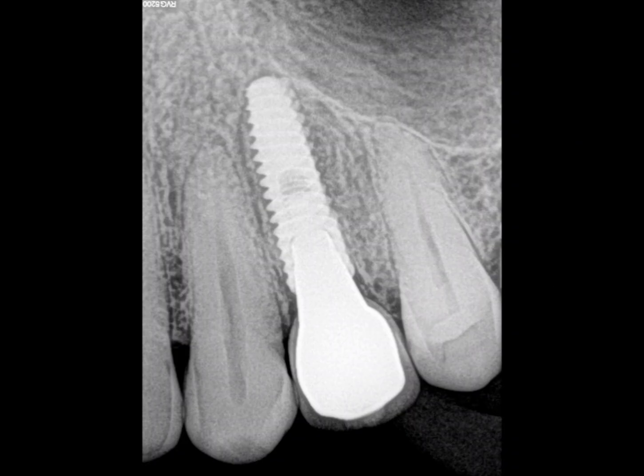Clinical pearls. This case highlights several important clinical points. First, immediate placement can be considered even in infected extraction sockets, provided proper case selection and meticulous debridement are performed. Second, CBCT evaluation is essential for identifying defects such as fenestration and planning implant positioning. Third, achieving good primary stability and performing guided bone regeneration are the key factors for successful outcomes.